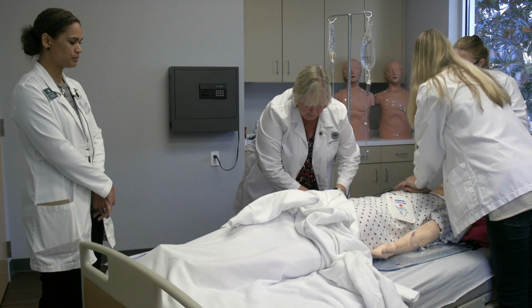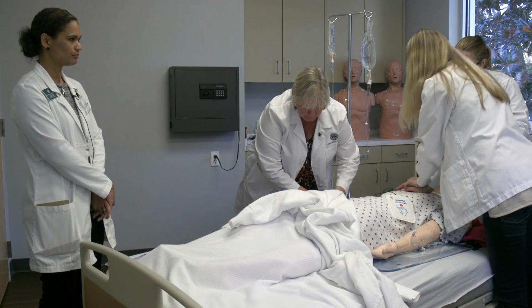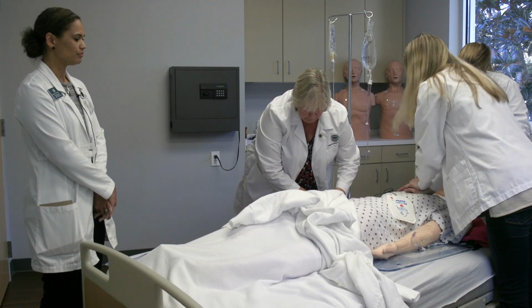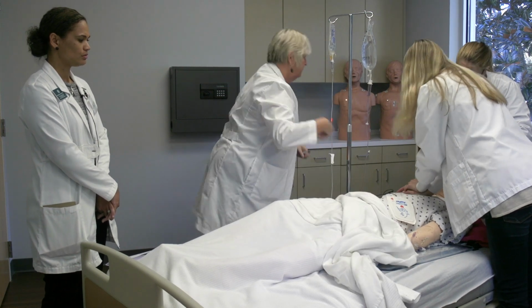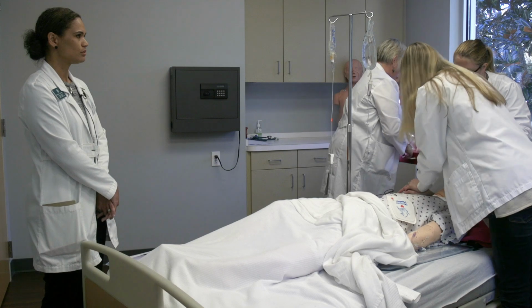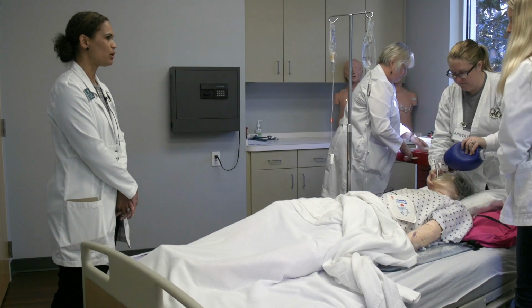Amiodarone 300 milligrams. 300 delivering. Followed by a flush. Amiodarone in. Okay, we're going to hold for a pulse check, please.